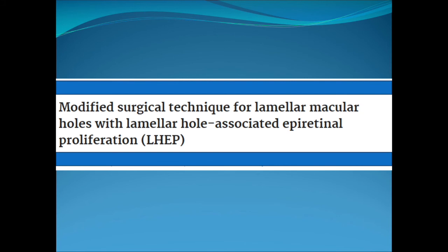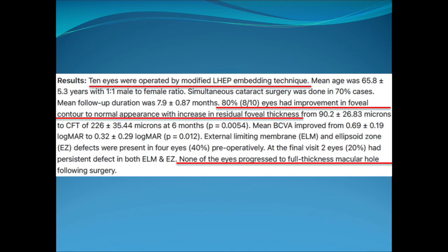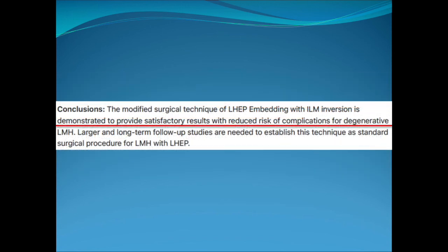Using the shown modification of 360-degree ILM inversion with LHEP embedding, recently we published a case series that showed 80% of the degenerative lamellar macular holes recovered with good anatomical and functional success and without any incidence of full thickness macular hole formation.